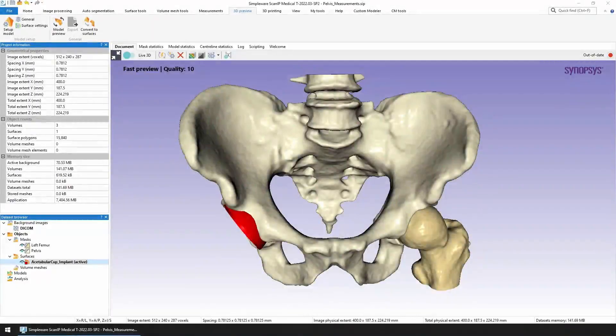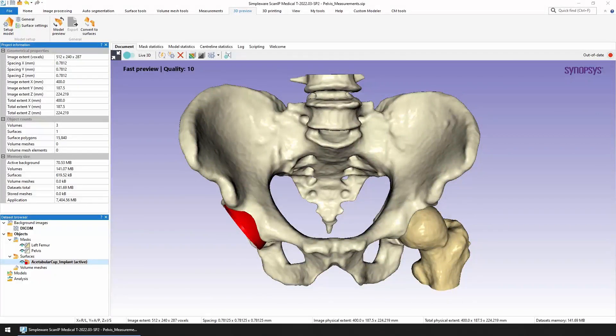Welcome to this quick look into the meshing capabilities of the Simpleware ScanIP software. In this video I'm going to show you some of the options we have available when preparing surface and volume meshes.